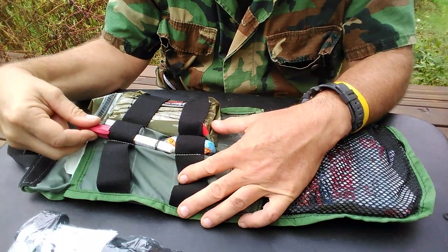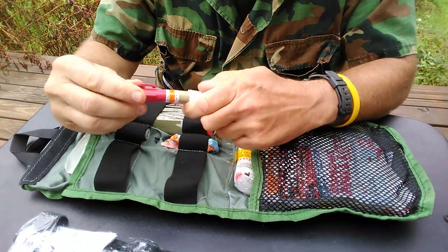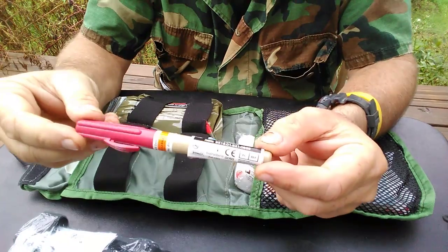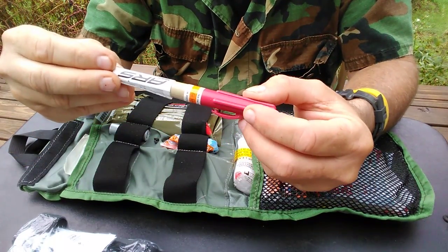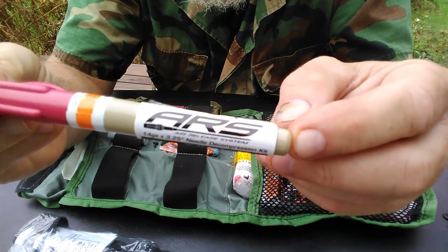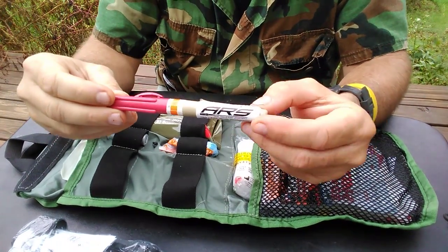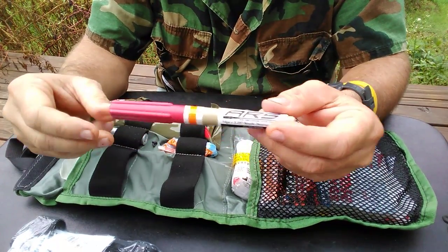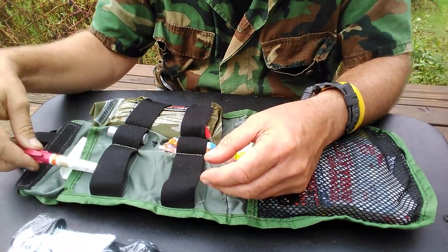Right here is a 14-gauge 3.25 decompression needle. This is sterile — do not use if the seal is compromised. This is for tension pneumothorax. You may not know how to reduce a tension pneumothorax, but somebody running into the area may, and you can say, 'Here, I have this,' so they can do that.